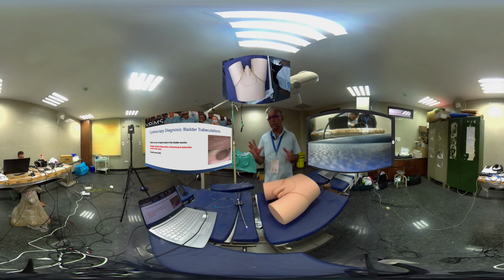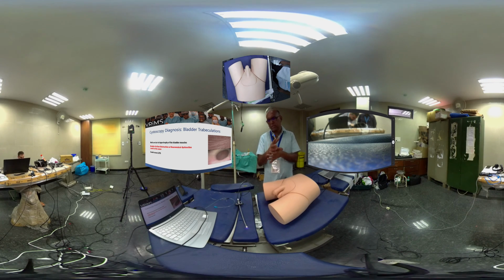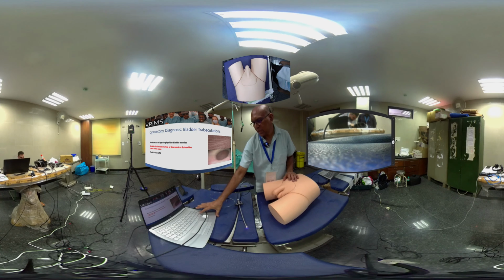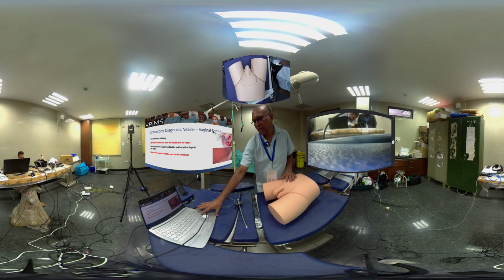And then these are showing some of the hypertrophied detrusor muscles, and the trabeculated bladder can also have this sort of mucosa which bulges through the muscles. And this is how a seaweed appearance, or this is how a bladder tumor, transitional cell tumor, will appear.